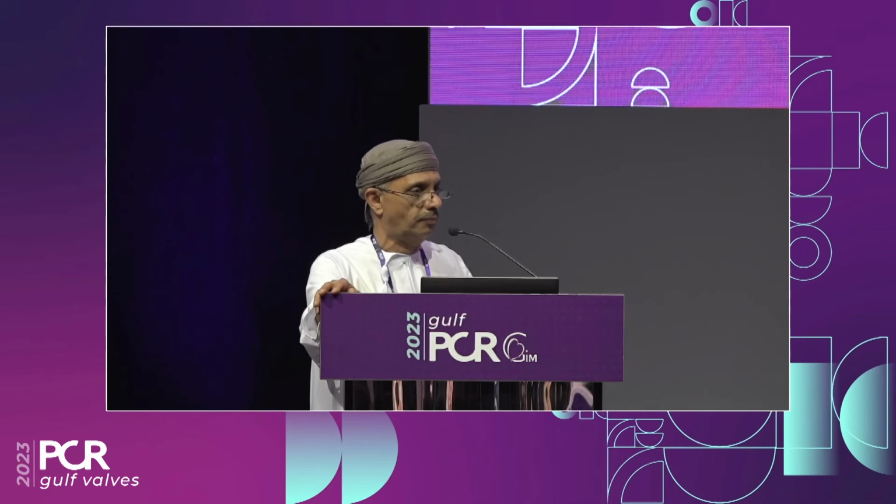Okay, do you try to achieve commissural alignment with this valve? We're talking a lot about commissural alignment, and I might comment on this. If you look at the valve, you have the 3 posts, and like 3 paddles, the attachment. So the same thing that you do with the Medtronic or the Accurate, you can go to your cusp overlap view, and position one of the posts facing the right side of the screen. It's less visible, but it does work.